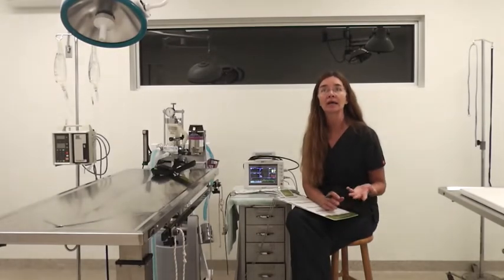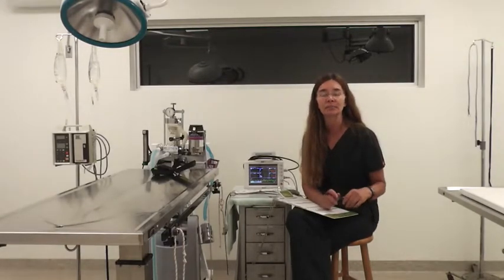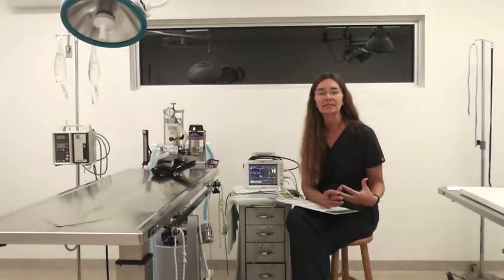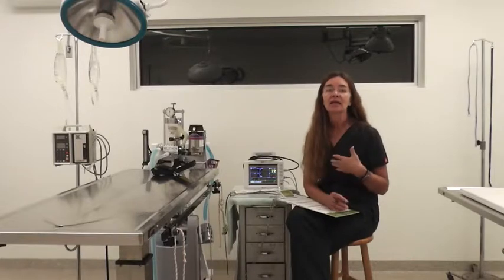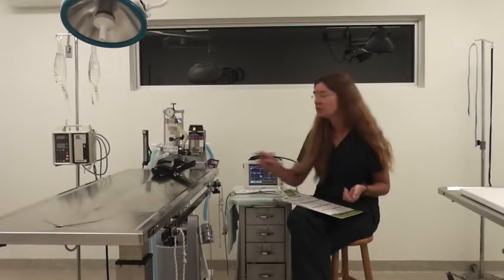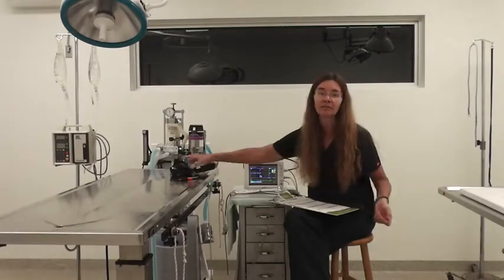For normal dog and cat respirations during anesthetic procedures, we want between 8 and 20. When they're at a good surgical plane, they're taking deep, smooth breaths. They should be bringing in as much oxygen as they can, and we want them exhaling carbon dioxide, which we can monitor through a capnograph.